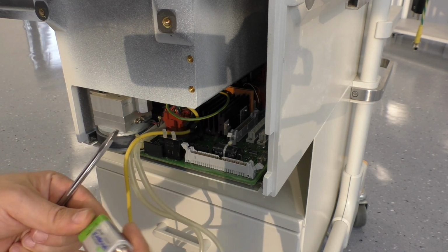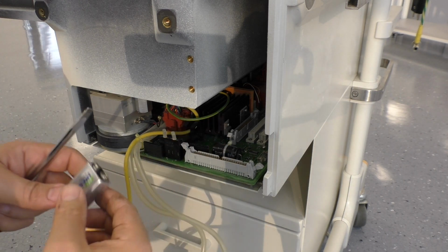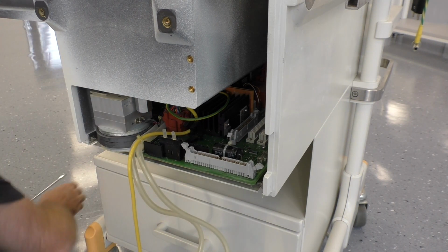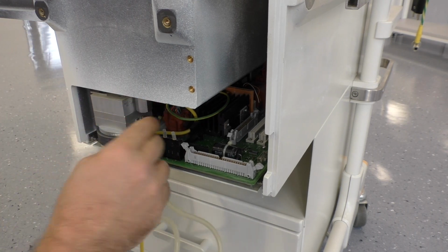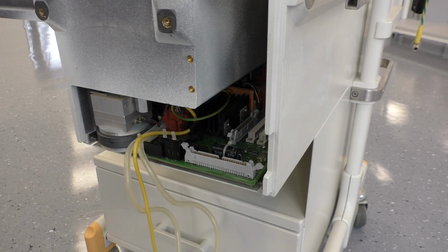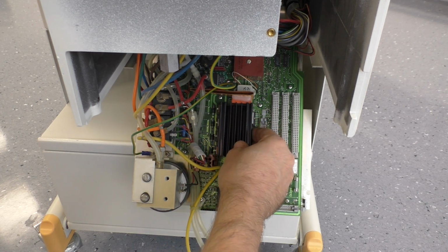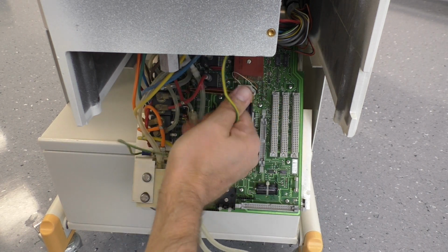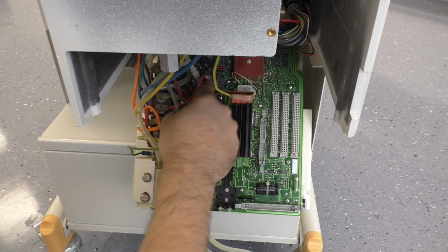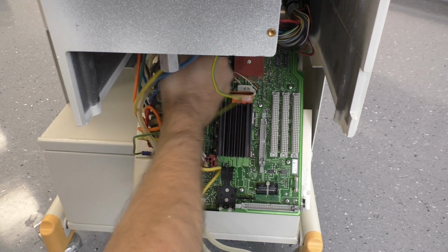We have a battery, a nickel cadmium rechargeable battery here, with a good battery holder, something I can use later. Off, but it is attached to something rubbery. Okay, that's a little bit more of it. Some power drivers, maybe for the main pump, back somewhere. A lot of hoses, a lot of pneumatic valves. This looks like a pressure sensor for the different types of gas we have here.